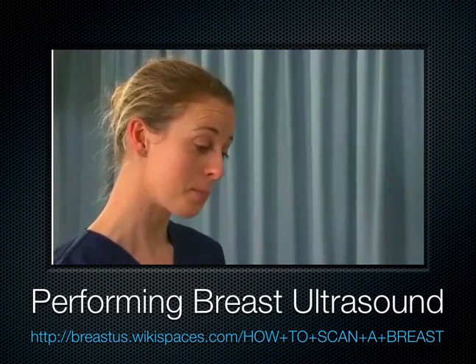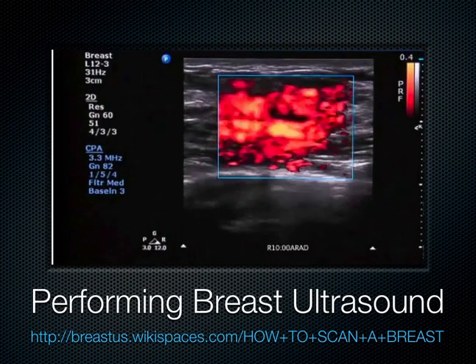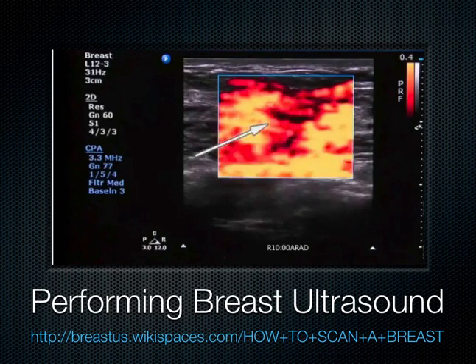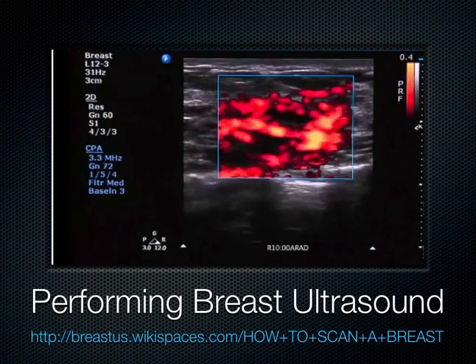Ask the patient to hum. Vibrations from the hum will pass through the chest wall and breast tissue. A lesion will not usually transmit a signal from the hum, causing the margins of the lesion to appear more distinct on the ultrasound image.